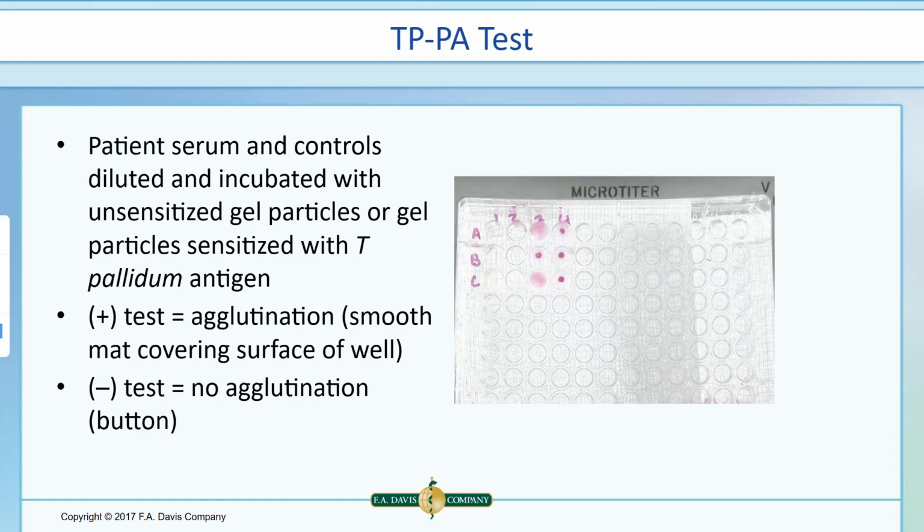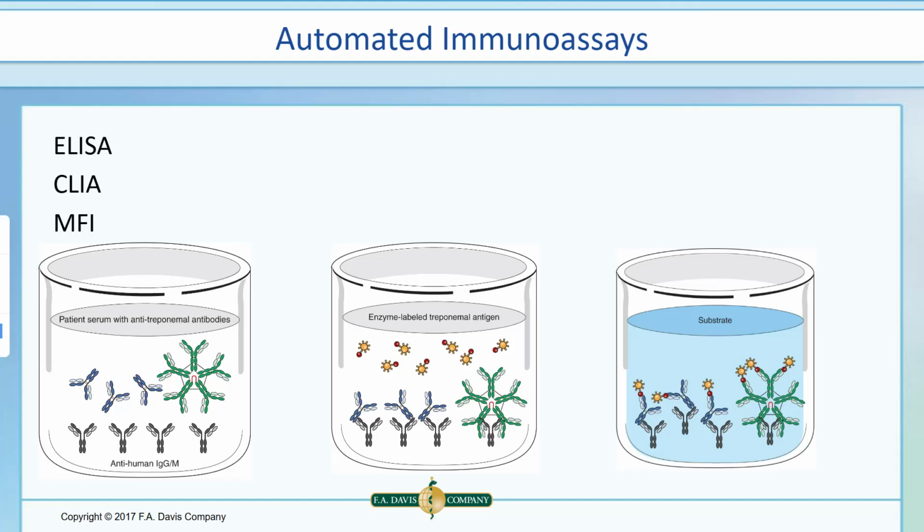And here's just a diagram of those tests that were mentioned previously. Typical antibody pattern in syphilis. So here you can see the treponemal antibody tests. Those will detect it. The percentage of patients who test positive is pretty high. And then you see the non-treponemal antibody test, the RPR or VDRL. If they were treated, you should see those go down. Left untreated, they should stabilize but still be higher than if treated.